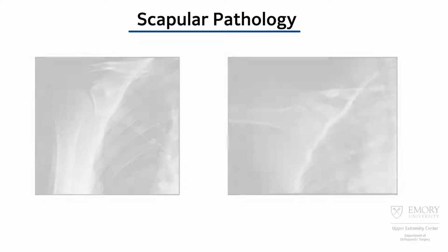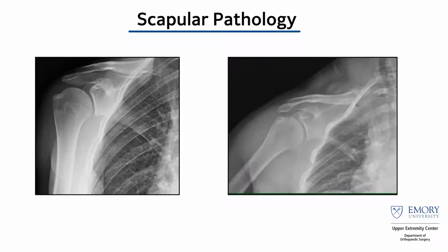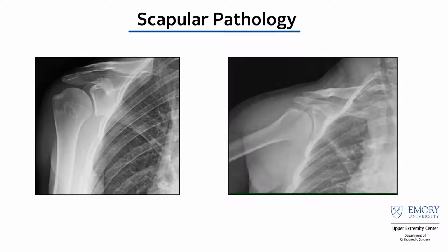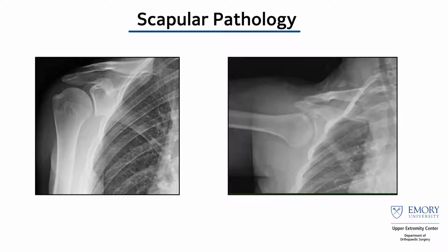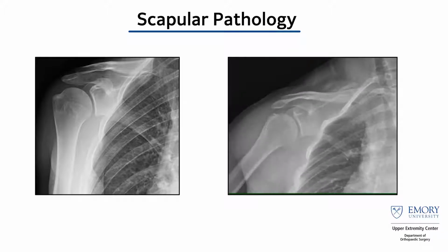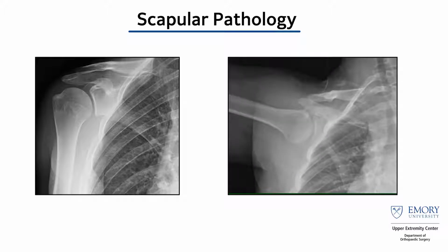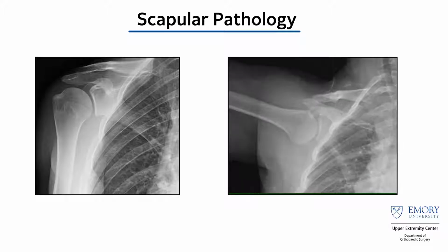So here's his DDR. So you can see how limited his scapula actually is moving. So his glenohumeral joint almost has full motion, but he has very limited scapulothoracic motion. That's because the serratus anterior is not holding his scapula against his chest wall, and he doesn't have the normal external rotation that most of us would be accustomed to. You can see how much more information you get on the right compared to just a static image on the left, which looks like, at least from my perspective, a very normal shoulder.